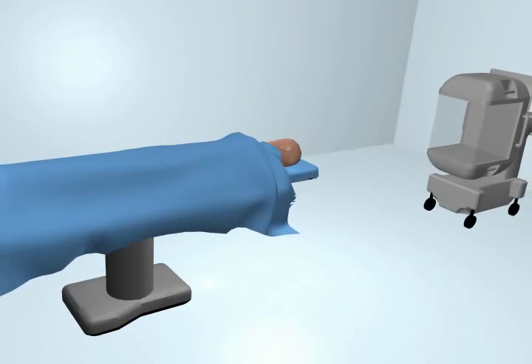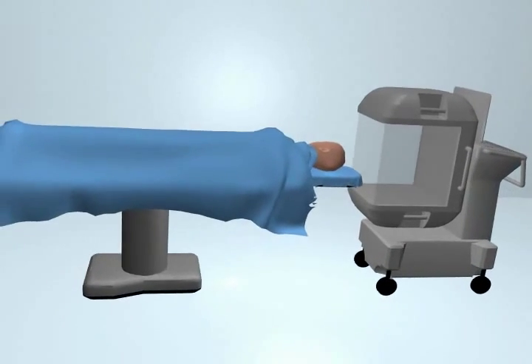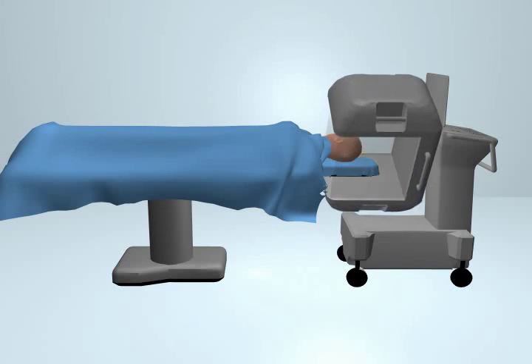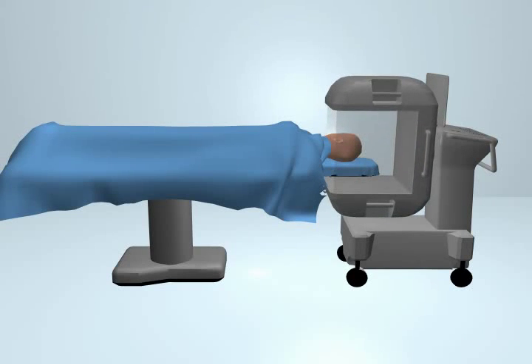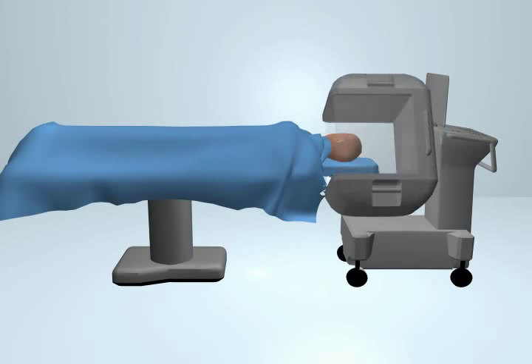Recent technological advances have allowed CT scanners to be miniaturized and made mobile so they can be used in the operating room. These devices, which are the size of a small refrigerator, are wheeled to the front of the patient's bed and rotated around the anatomy of interest, in our case, the head.